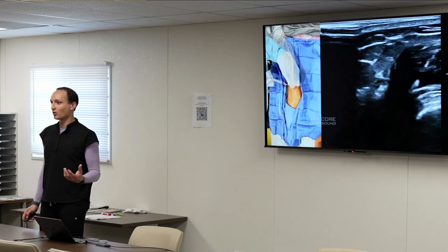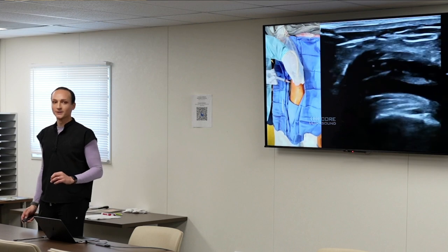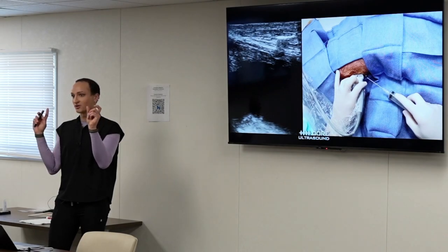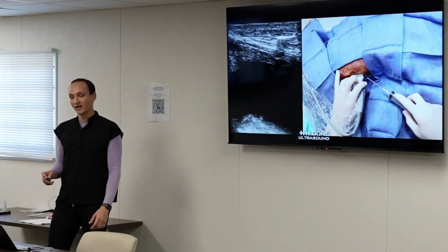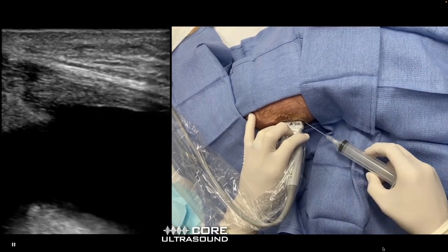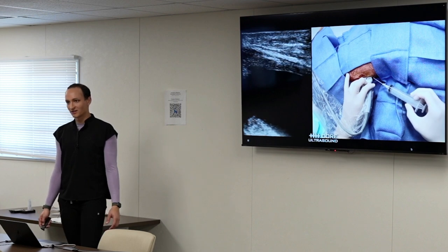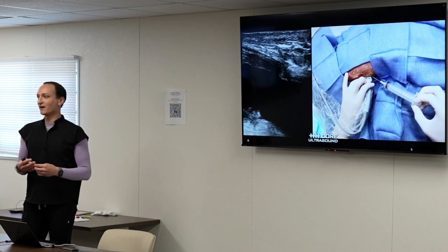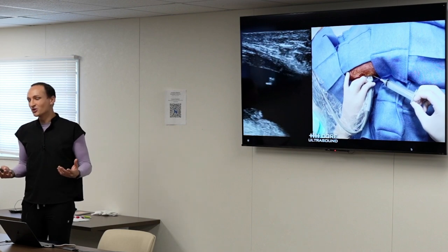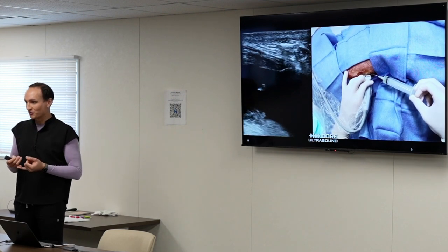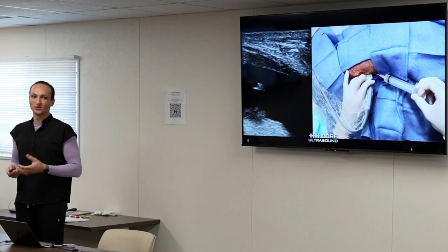Notice how much brighter the 20 gauge needle is compared to the 27 gauge in the earlier examples — much easier to see. There's a little fat in the joint to get through, which can be tricky. My technique is similar to paracentesis: poke the skin and then either lift or lower the needle hub to curve the tip toward the pocket. Even for a large effusion, ultrasound helps me go straight in without digging around.